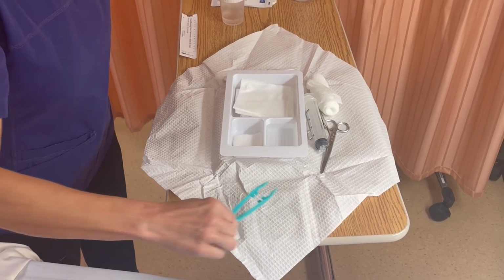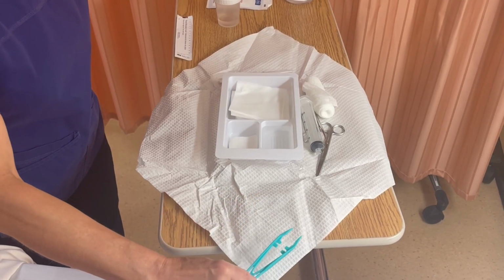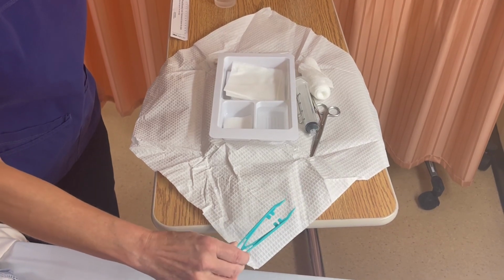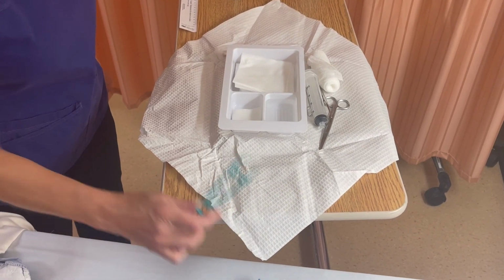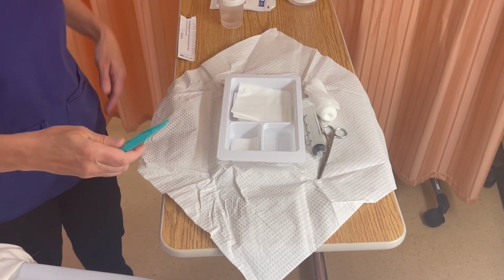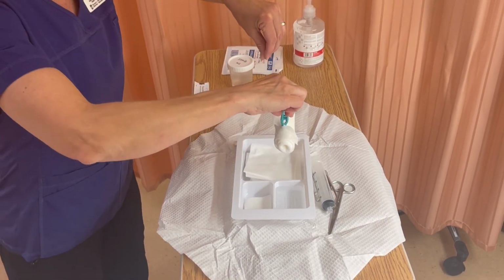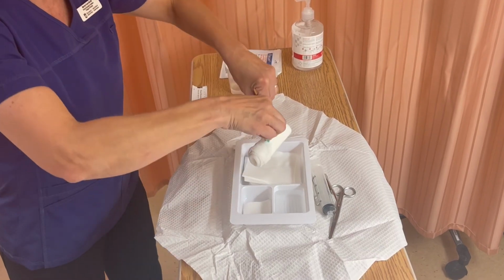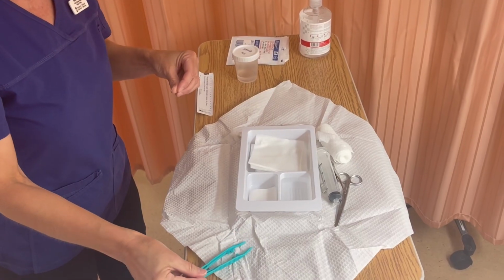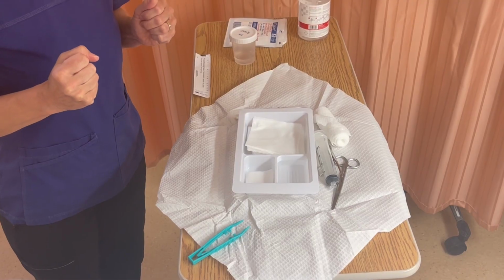Another thing to be very careful of is when you see a 1-inch border like this, we have seen students place their forceps actually right in the 1-inch border on this side, even though it's within the 1-inch border on this side. Another thing is when you are taking your supplies out of the packaging, we always want you to be considering keeping your wrists up. There's a tendency to want to drip and drop your wrists, but we have to make sure we keep our wrists up to maintain sterile technique. It's aseptic technique. These are some of the key features that we want.